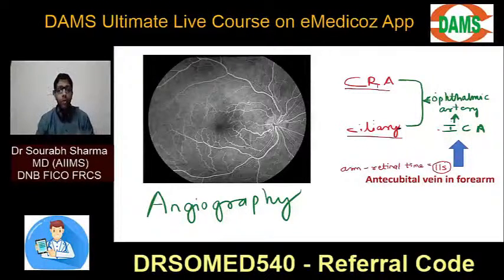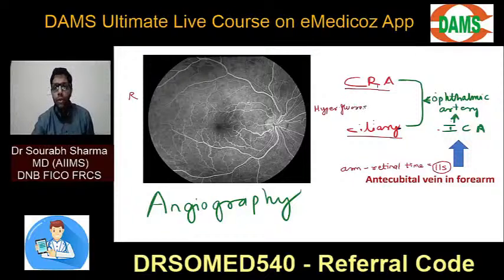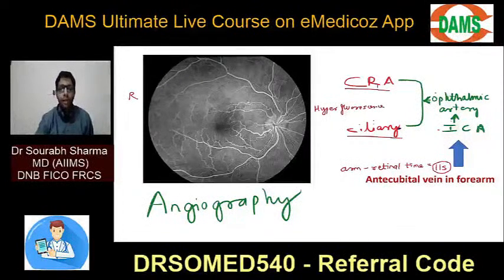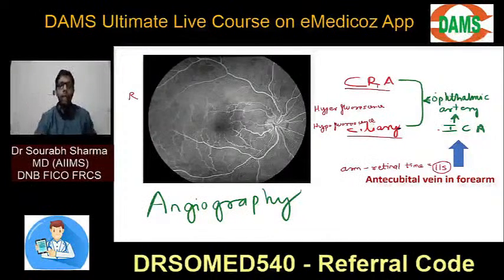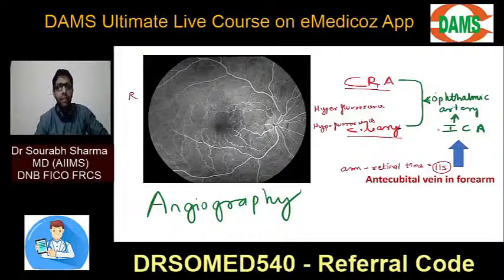Okay, now you see this right angiography. White means there is dye, and white means hyperfluorescence. Dark areas, dark means hypofluorescence. So you have to remember these 2 words. Hyper means more dye, white, and hypo means less dye. Of course, when you put a dye, the vessels have the dye. That's why they are white. You can see the vessels are white, they have dye.